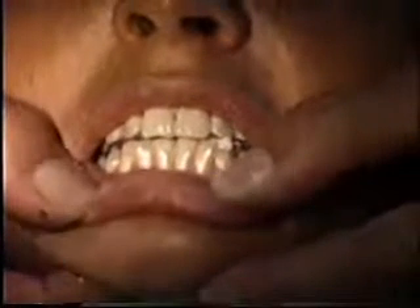Now at this time, after the material is set for about five minutes, we will have her open and then take out the appliance and complete the curing either in some warm water or in our hands. We will have her try opening and closing after the material is hard to see if she attains the same position.